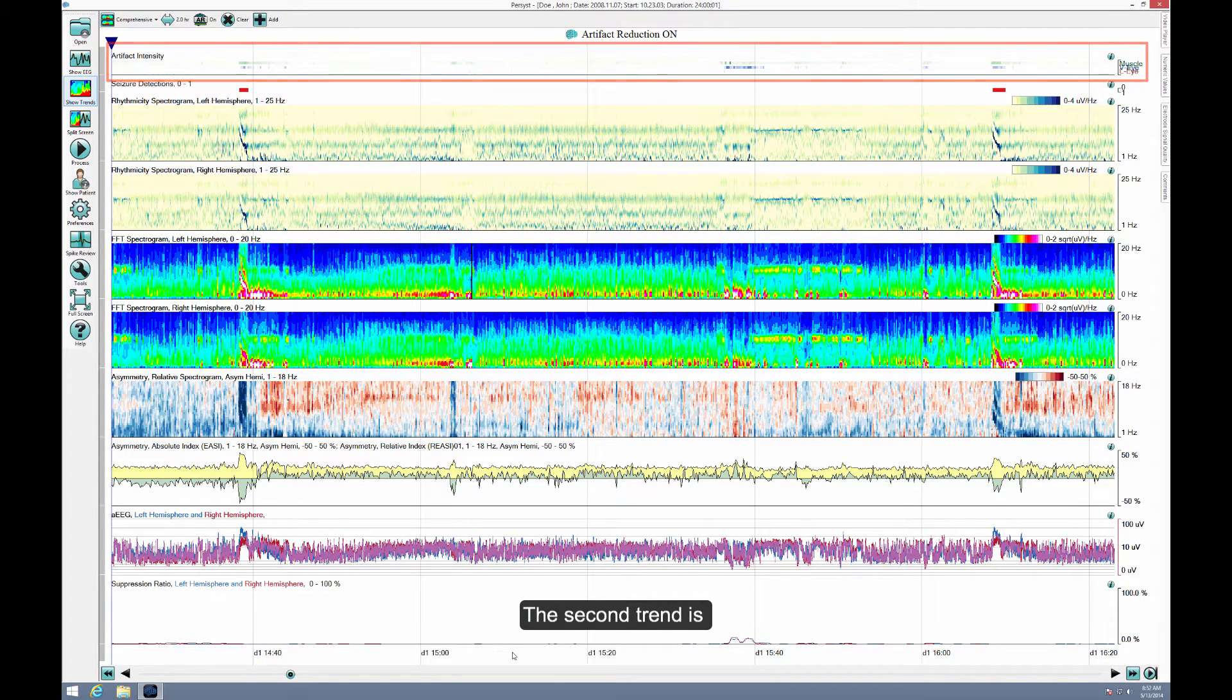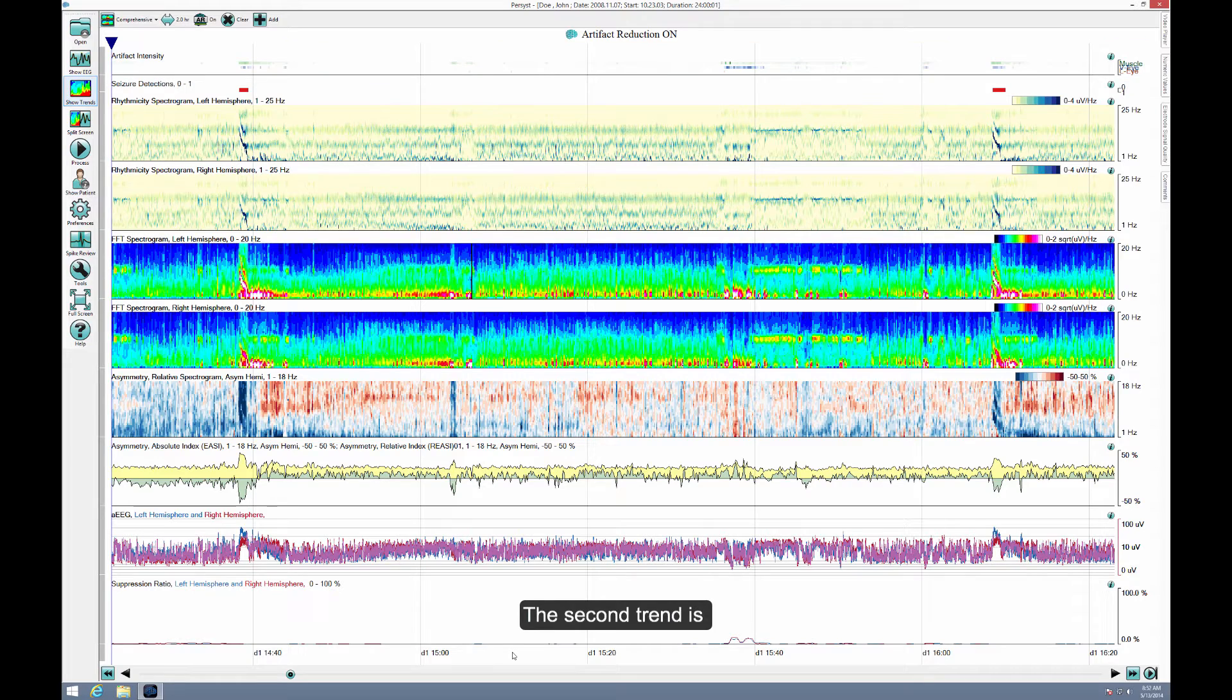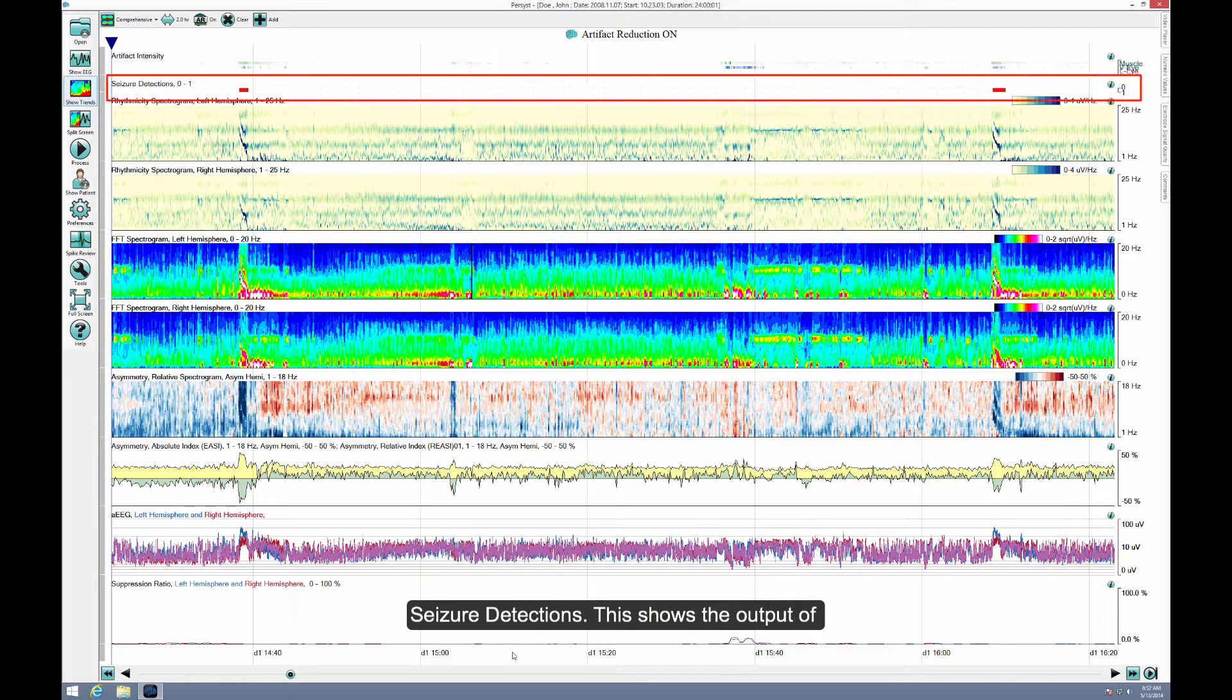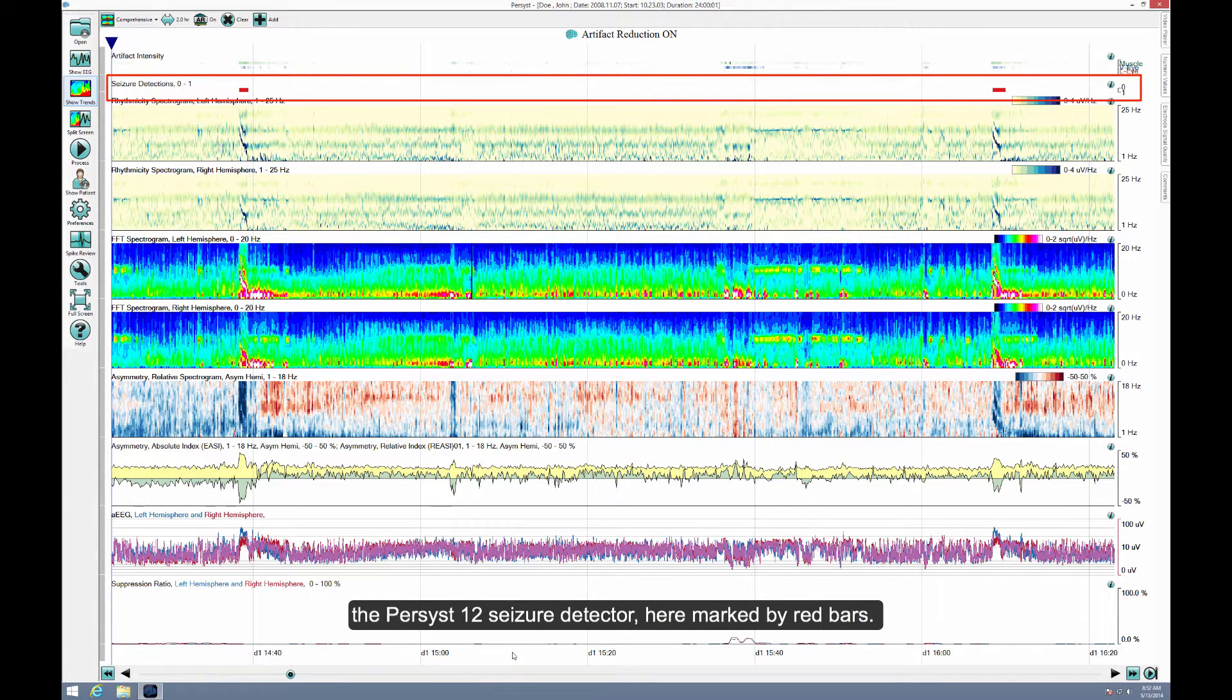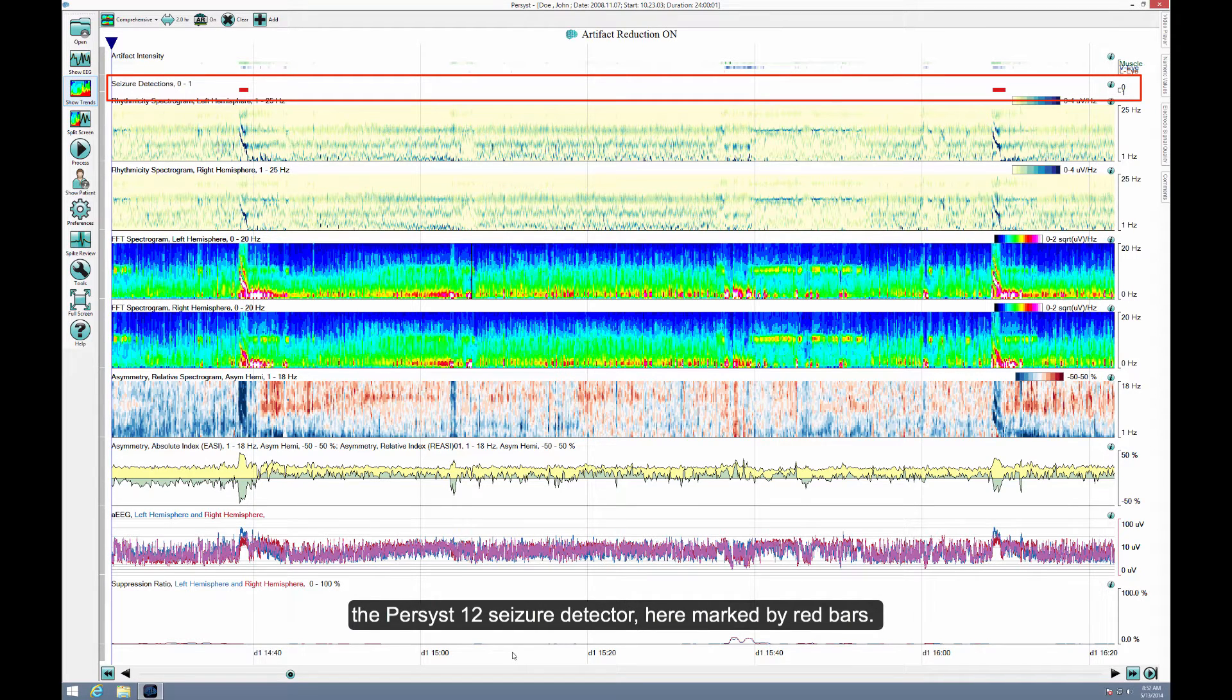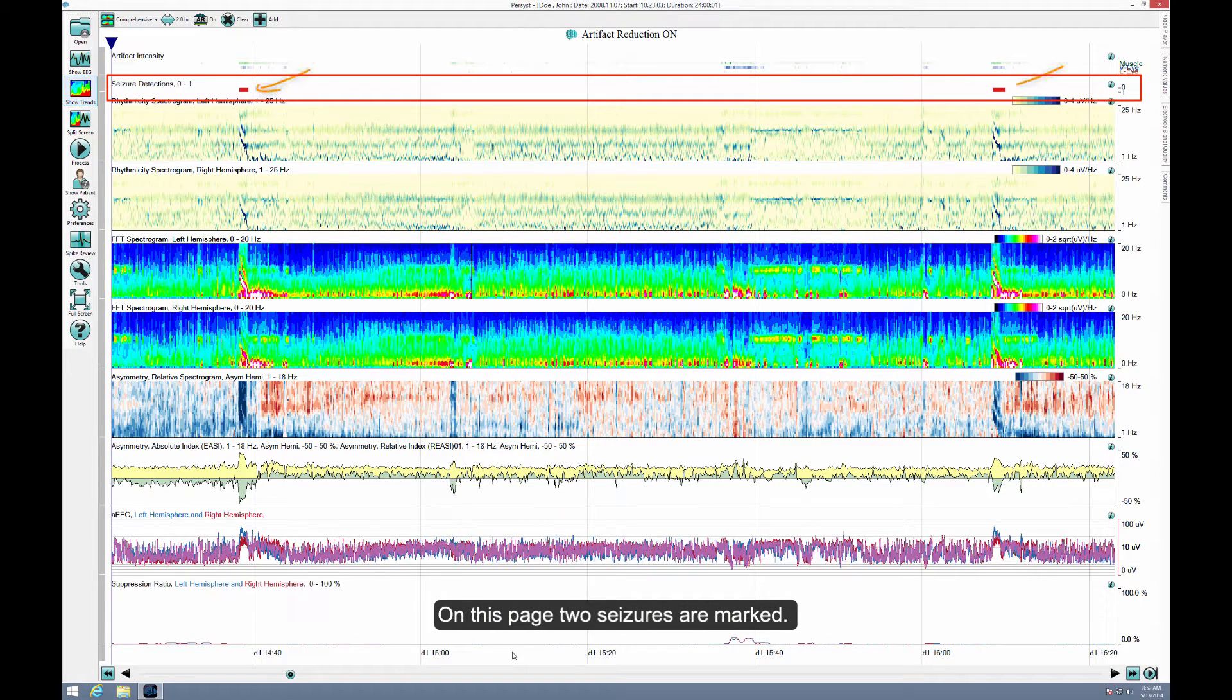The second trend is seizure detections. This shows the output of the Persyst-12 seizure detector, here marked by red bars. On this page, two seizures are marked.